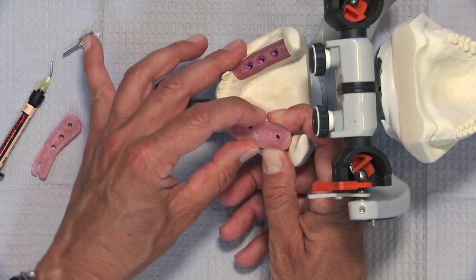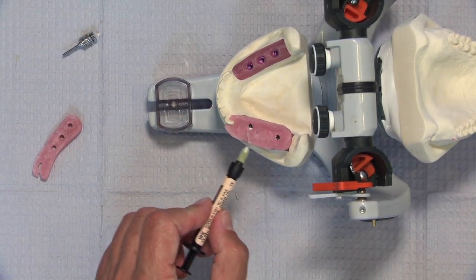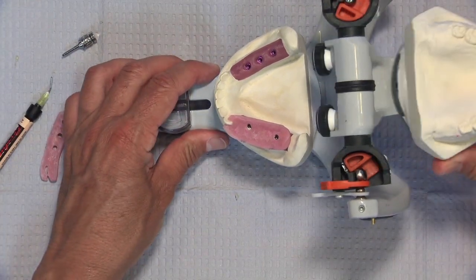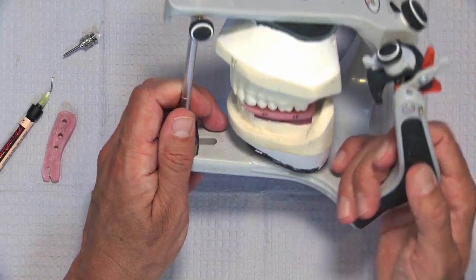Now typically when you get this back from the laboratory, what we're going to send to you is going to have the occlusal surfaces of the opposing teeth already in place here in this hard acrylic. So when you put this into place, the first thing you're going to have the patient do is bite together and verify and see if you happen to get the bite right.